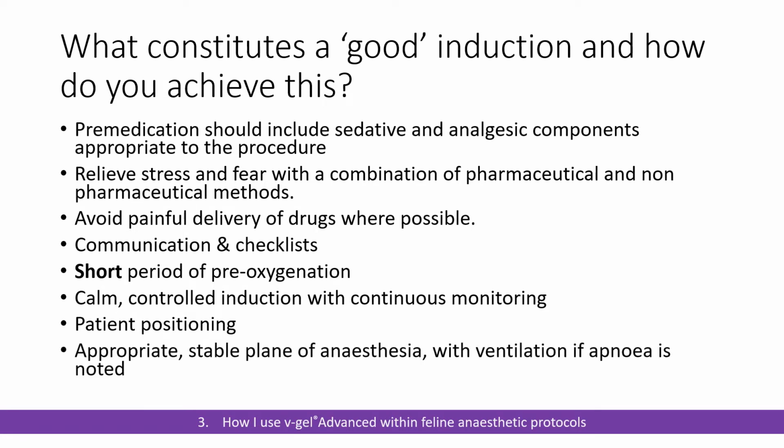And the final endpoint of induction, you're trying to get to an appropriate plane of anaesthesia that's appropriate to what's coming next. It's stable, you haven't got the depth of anaesthesia changing all over the place, and you're ventilating your patient if you're seeing apnea.